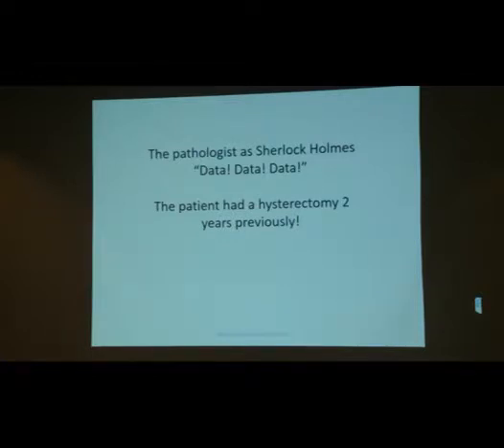If they had told me that this patient had a hysterectomy 2 years ago, I would have been thinking about prolapsed fallopian tube straight up, because that is the usual history. The patients had a hysterectomy, then they present with some funny bleeding thing in their vagina or some nodule, and you take it out and this is what you see. And because it's inflamed, it's got mitotic figures, it's got reactive atypia, and it all looks very funny.